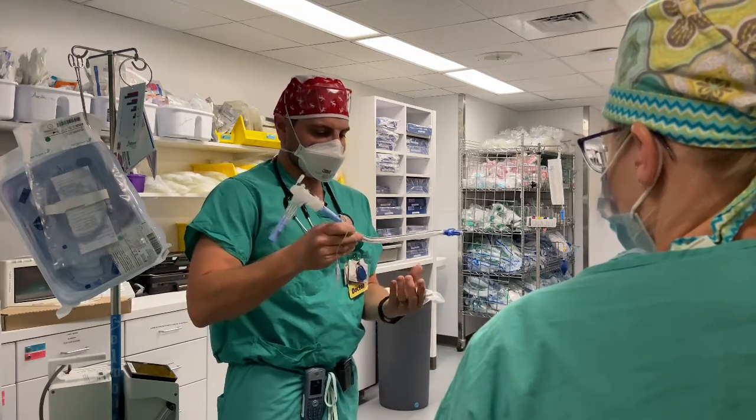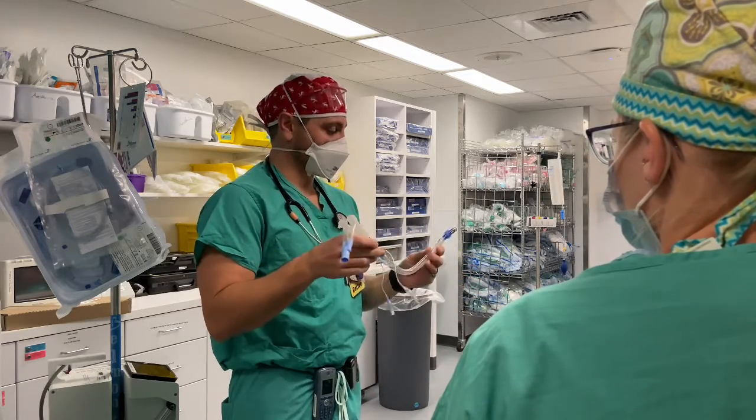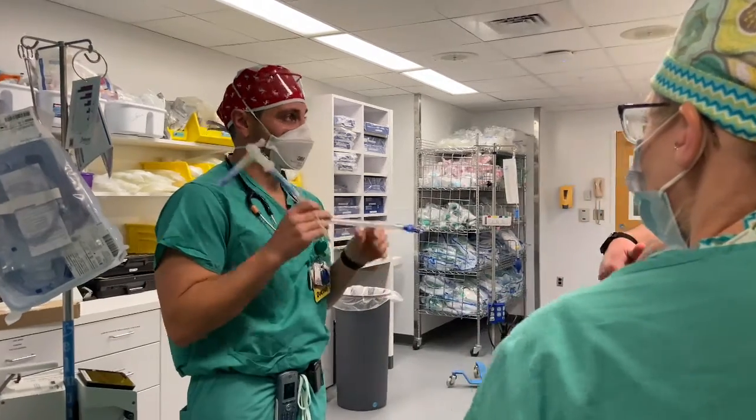So why would we select this over a bronchial blocker? Well, it's easier to place. It's more reliable in most cases in terms of getting good lung isolation.